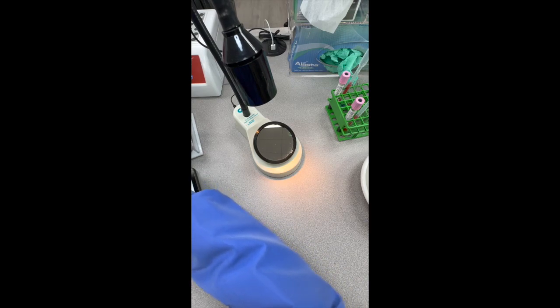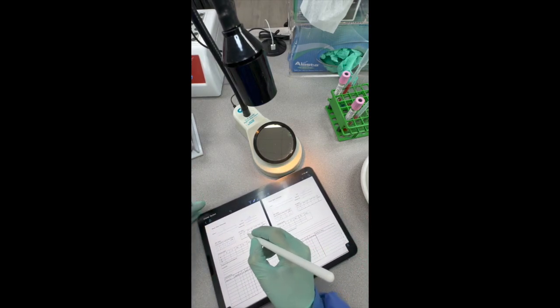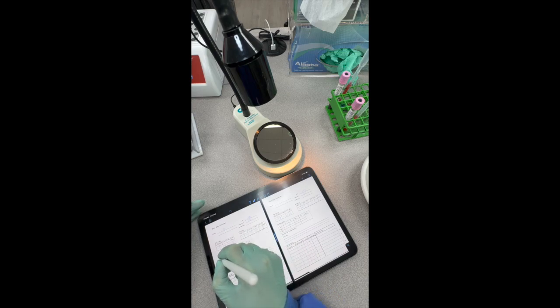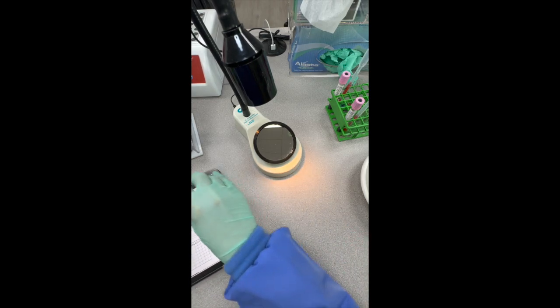So I'll record those for H, because remember, I am working on 2 patients at the same time, and I do not want to mess those up. So I'm going to go ahead and just right here at 37, I'm going to put a negative. This would have been for my screen, but we're using this for a weak D today, so I'll just write that in there. Okay. That looks good.